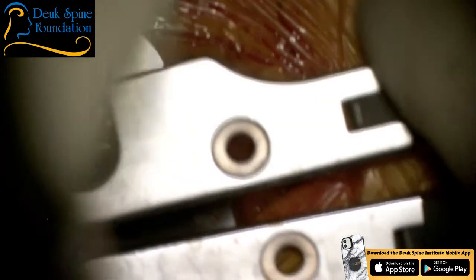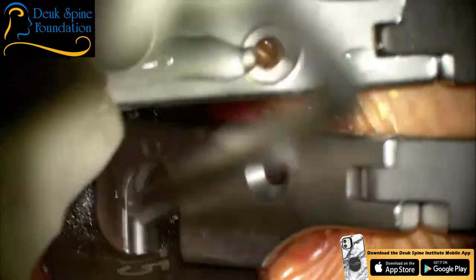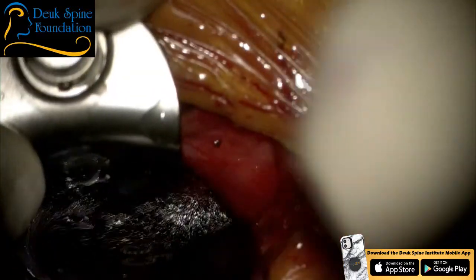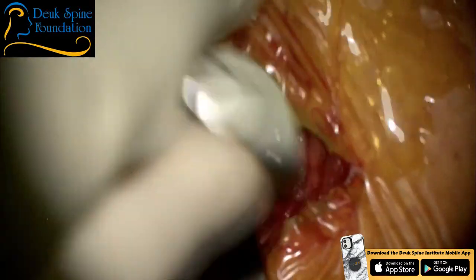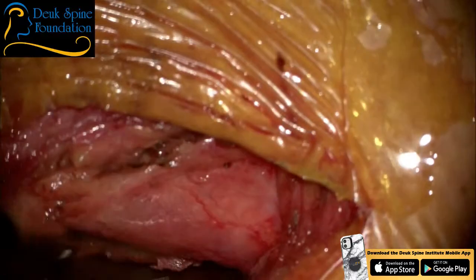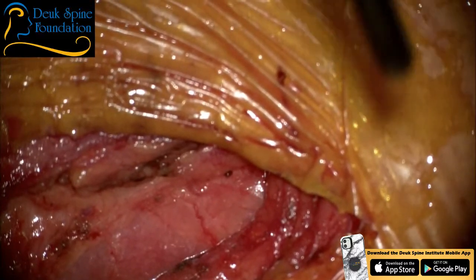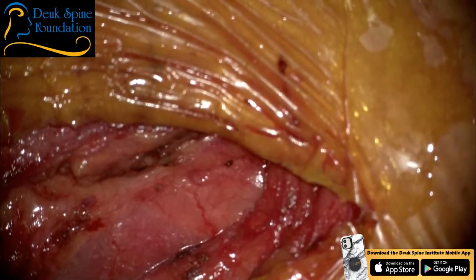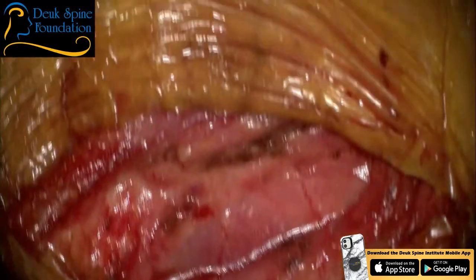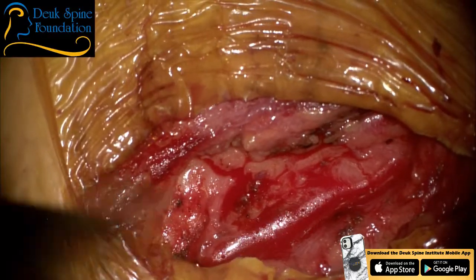Let's irrigate. Actually, we can't even get an x-ray. Yeah, we need irrigation just a little bit. And then I need, how are you going to reverse? Neostigmine? Neostigmine's fine. We got another 15 minutes before we have the bandage on. I really am hoping he has two twitches, because that's where I really want him to be at this point. All right, let me get in. By the time we're closed, he should have two.